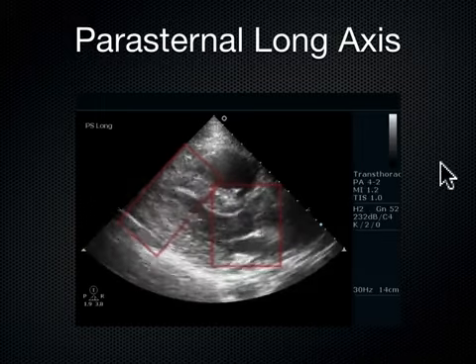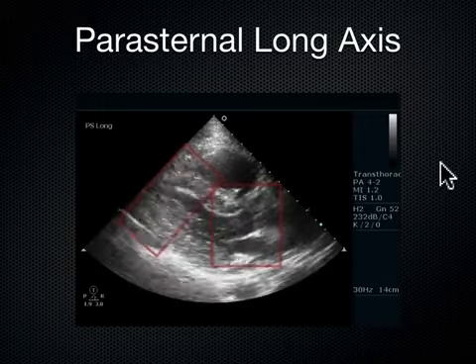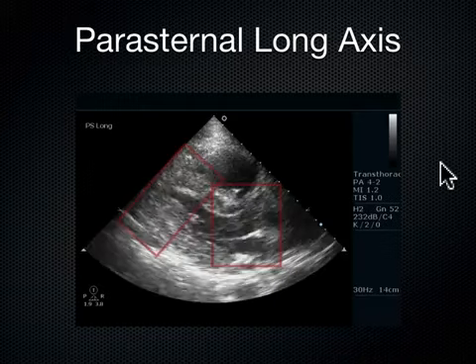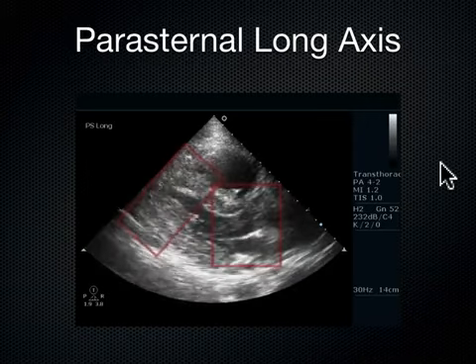What would cause that? The right ventricle is trying to pump blood to what organ? The lungs, right? So the blood's trying to get out to the lungs. If the right ventricle is straining so hard to push that blood out to the lungs because something in the lungs is not letting it get there, like a blood clot, pulmonary embolism, if the blood can't get out there, the right ventricle just starts to get bigger and bigger. We call that RV strain.